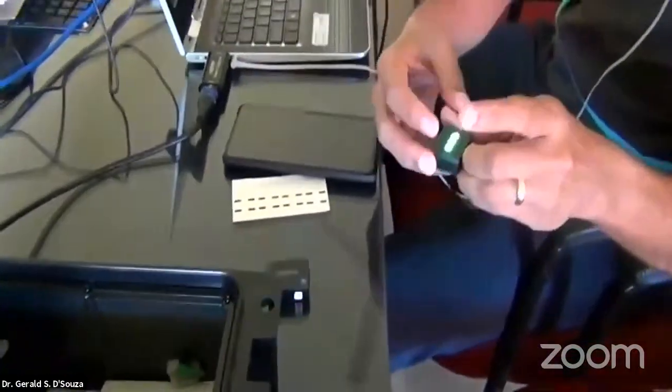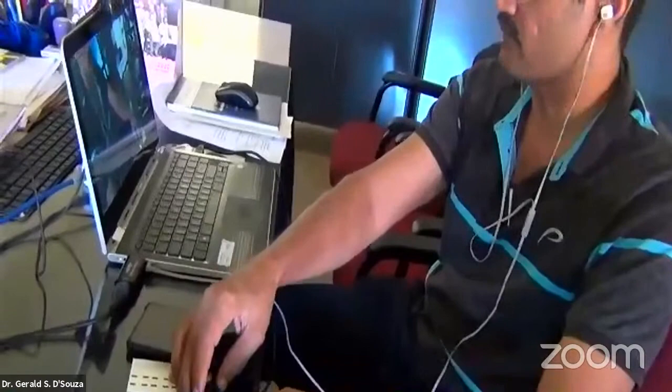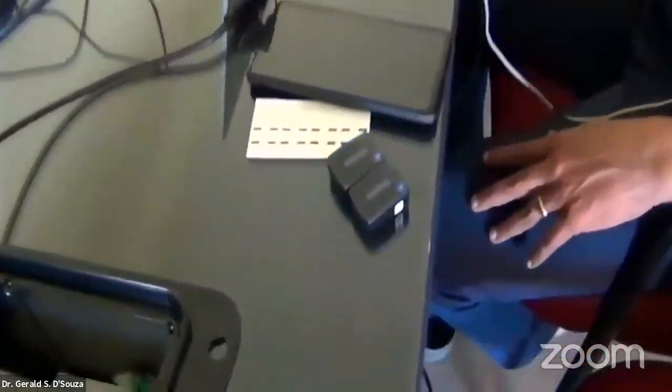So these are the two sensors. Now what we have to do is, once the sensors come out, we have to sync them.